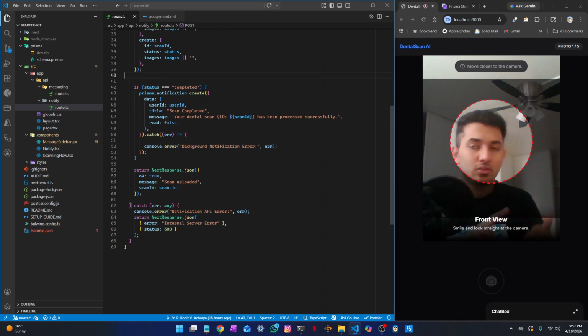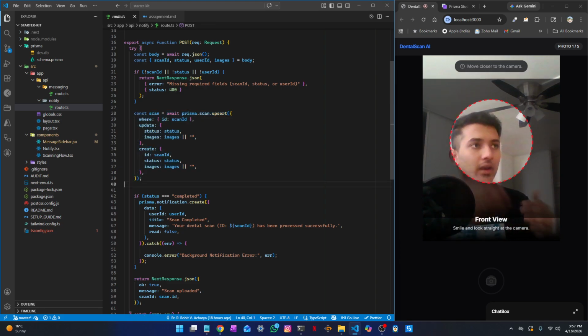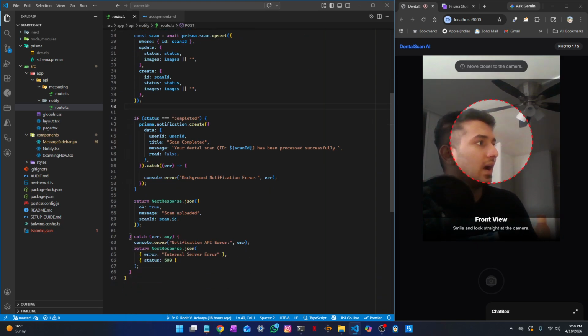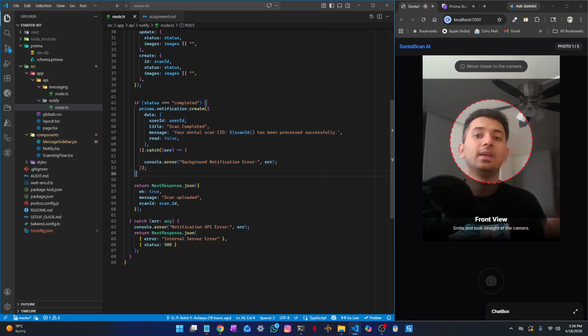And just to give the user a rich UX feel, as soon as the user uploads, the user will get a notification on the screen that the dentist will be connected. But in the background, asynchronously, what happens is, using the web APIs, so basically this is JavaScript, using the web APIs, this call will be asynchronously processed in the background. After that, there will be a notification created for the dentist. So here I've not got a chance to implement the dentist UI, but if given a chance, I would also like to implement that as well.